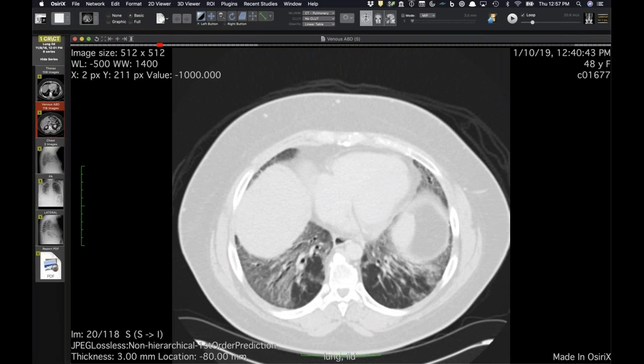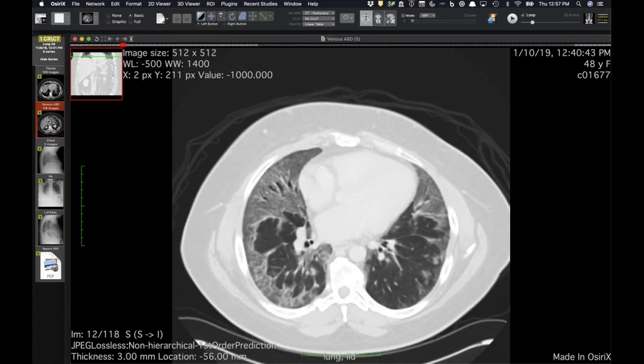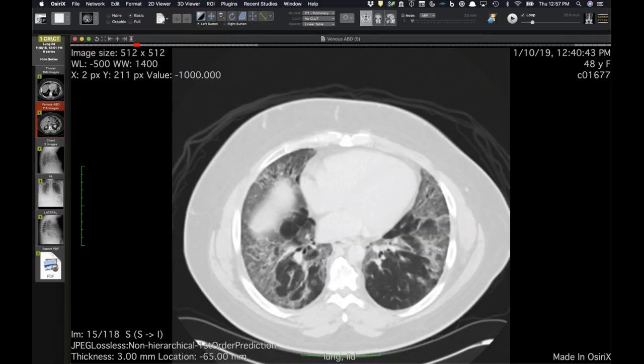So depending on what they biopsy, if they biopsy just the periphery of the lung, they may have missed the NSIP portion of it, because of course there's sometimes subpleural sparing. Yeah. And it's hard to know what kind of biopsies, especially in more community centers. Sometimes a thoracic surgeon takes tiny little nibbles and maybe only does one lobe. Right. Instead of three big chunks like our surgeons do, and probably yours do too. Yeah. Lobectomies. Right.